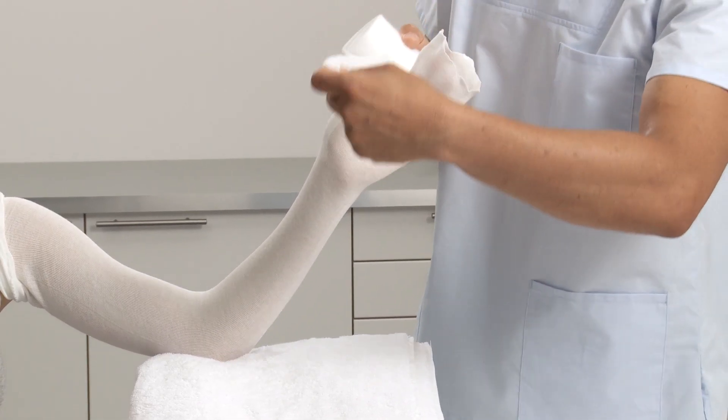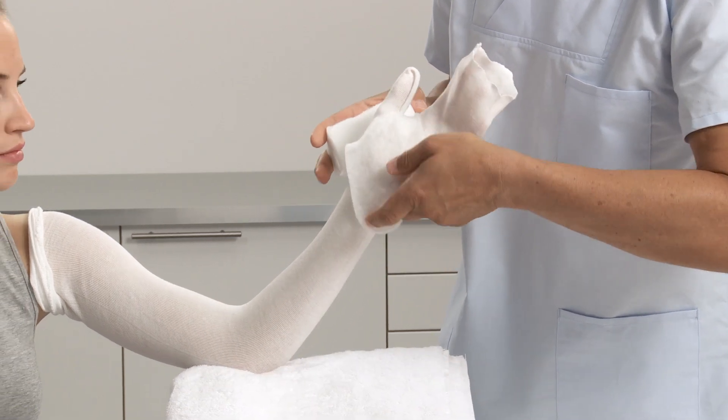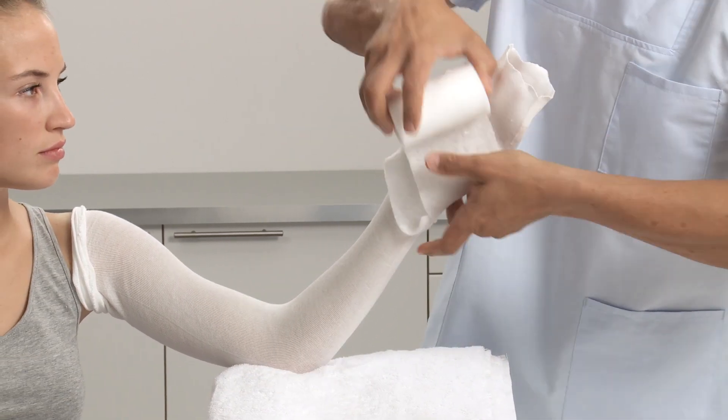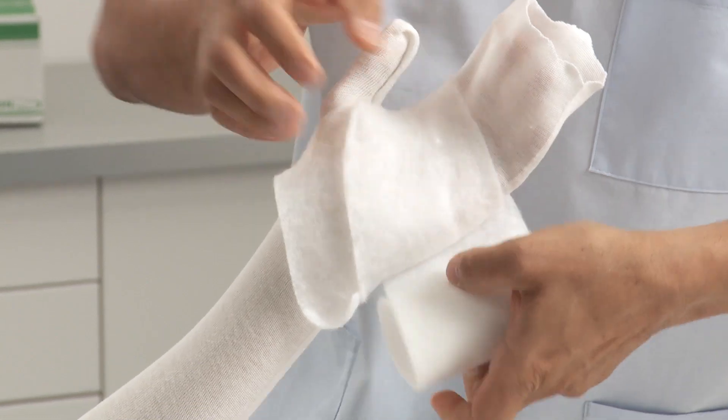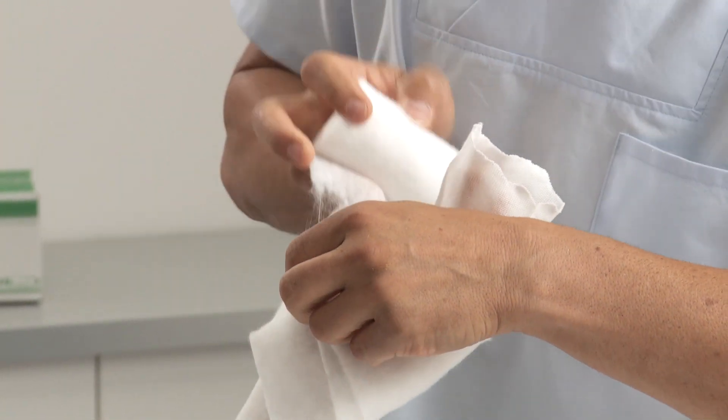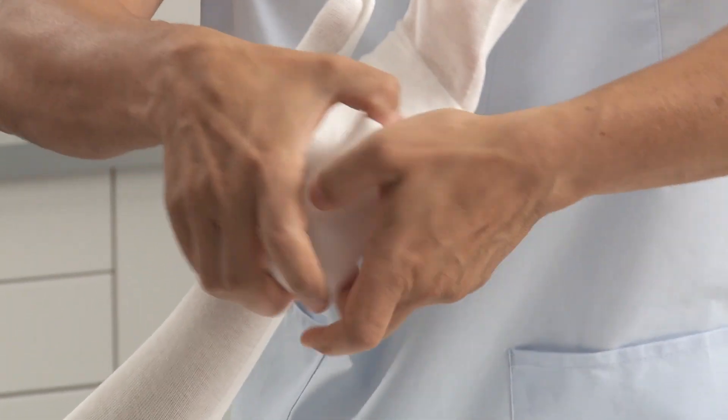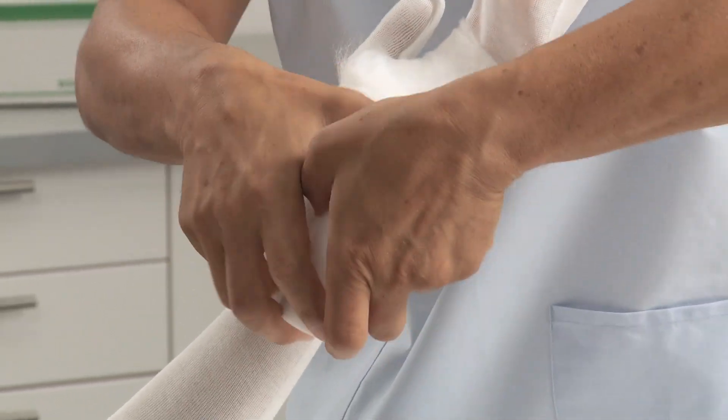Apply padding to the limb. Make sure you have enough to protect bony prominences. Cut a small hole into the padding roll and slide over the thumb. Pass the padding twice through the web space.